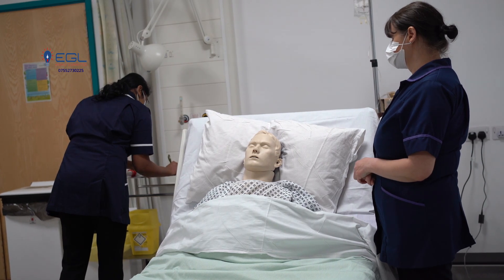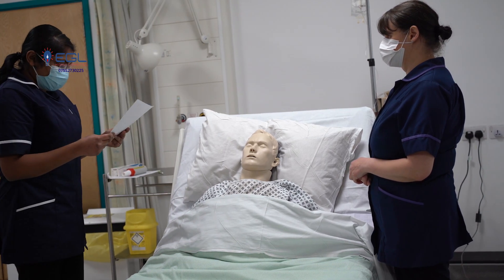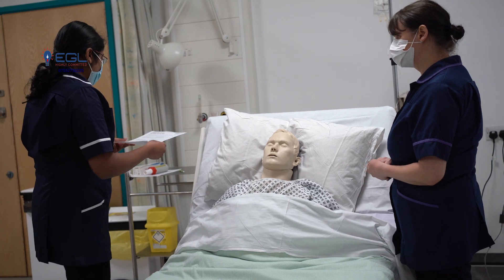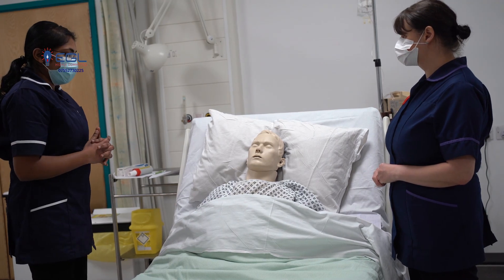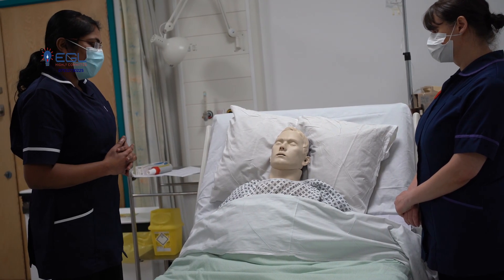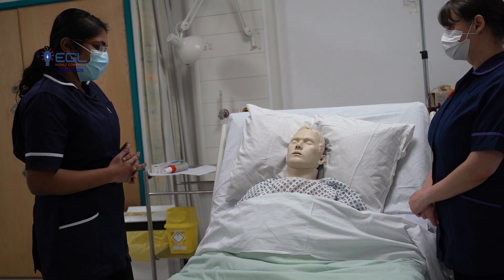Thanks Peter for your cooperation. According to our three readings, your highest peak expiratory flow rate is 460. According to the protocol, if the difference between the highest reading and the expected flow rate is more than 20%, that means your condition is worsening — at that time we will start the asthma action plan. In case of emergency, you can dial triple nine. Is that clear? Yes. Do you have any other concerns? No.